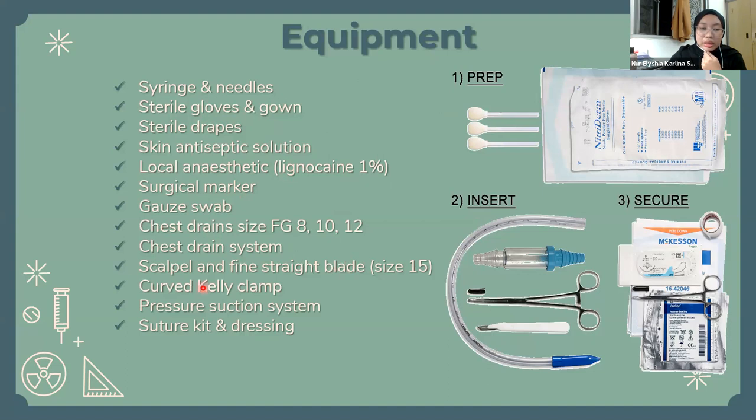Scalpel blade, curved Kelly clamp, this one. And then the pressure suction system and also the suture kit and dressing. As you can see, this is used for prep, insert, and also for the suture.